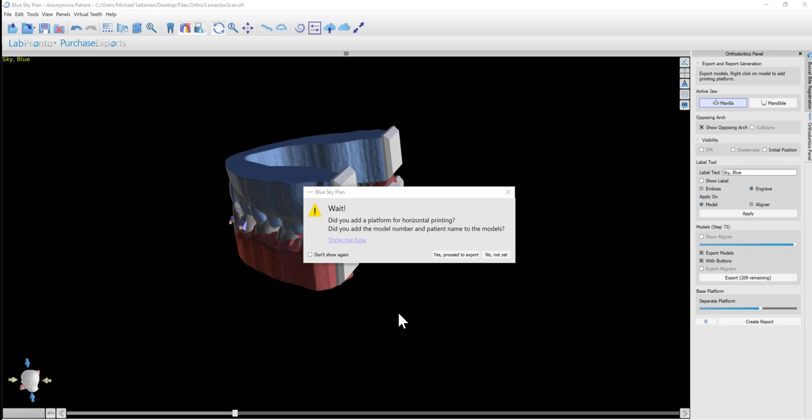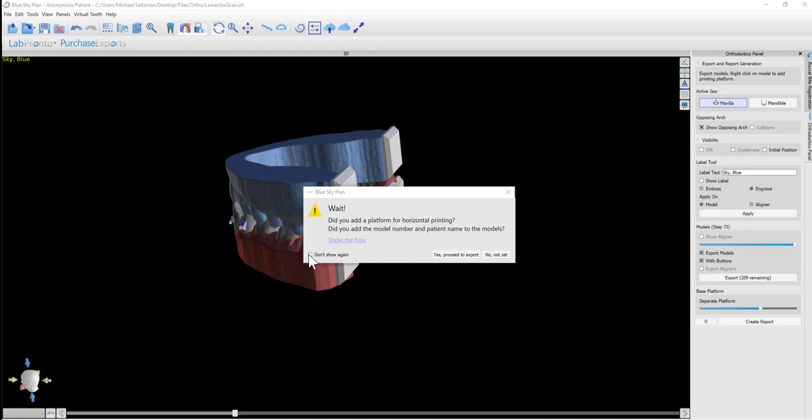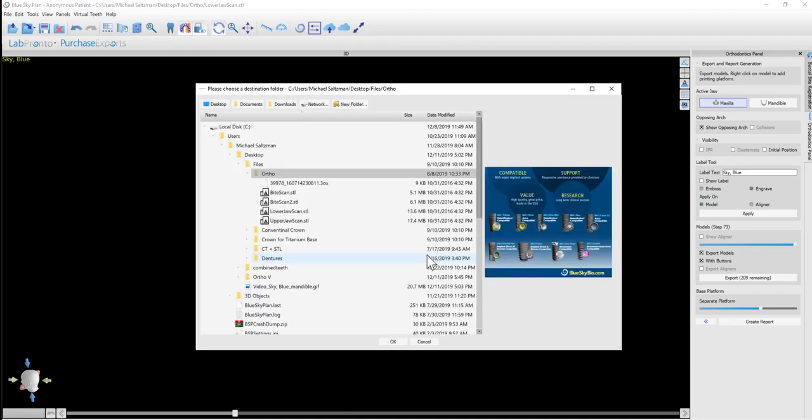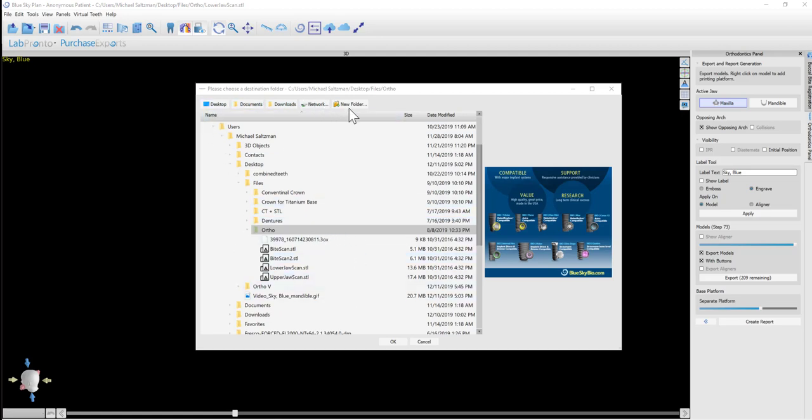Here again, the software is reminding us that before the export, to add the platform for printing and to add the model number and the patient name or unique identifier to the models. If we've done so, we just click Yes, Proceed to Export. Or No, Not Yet will cancel and allow us to go ahead and do that. Or if we don't want to get this message anymore, we just click the Don't Show Again checkbox and Yes, Proceed to Export.